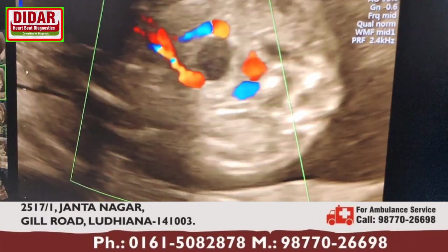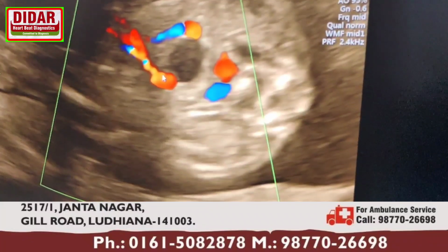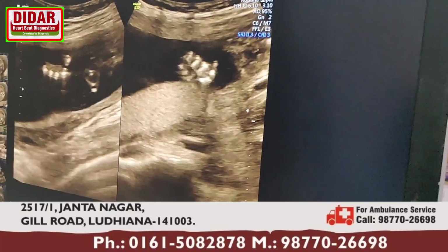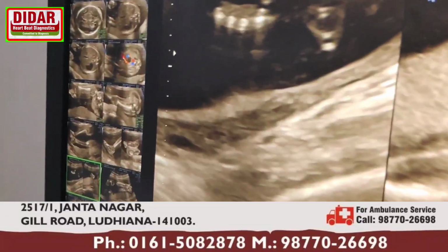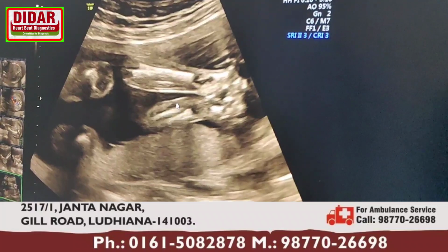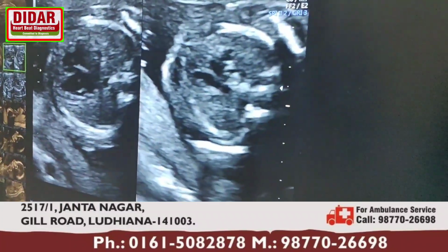Then there are two umbilical arteries. In the cord there are three vessels: there should be two umbilical arteries and one umbilical vein. And again the baby's feet. Then there are the tips of the fingers, five tips of the fingers here, five here. So both the hands I have seen. Now we can see two hands together, so it means there are two arms. Then this is again the spine photo. And then this is the heart photo.